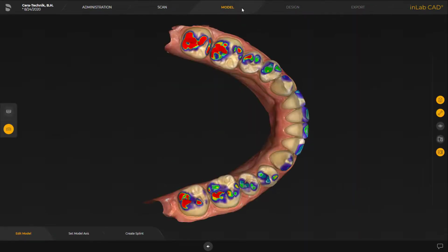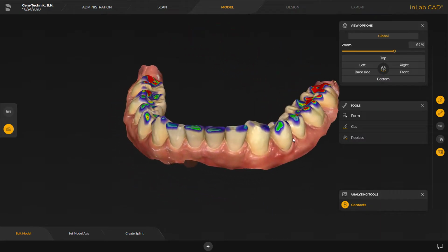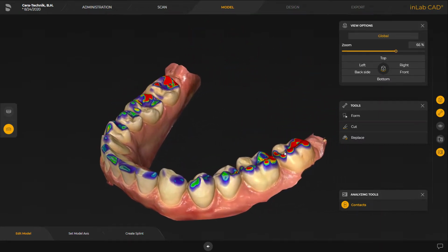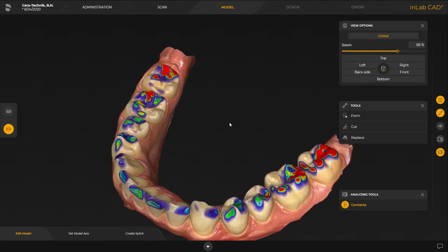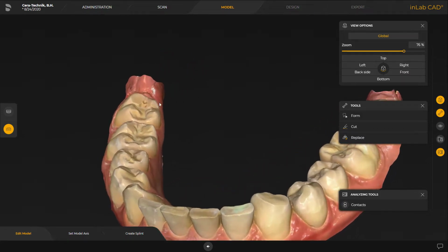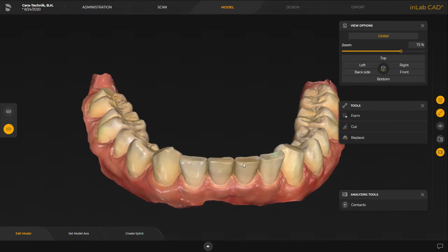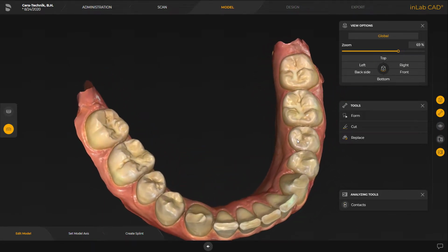And in the next step, we could double check the occlusion, for example, and in this case the scan was made out of a prime scan. And we can see here a solid bite. Color is the same on the whole area. And when we deactivate the contact points, we already can see the abrasive area. So in this case, it's probably a good job to do a night guard for this kind of patient.